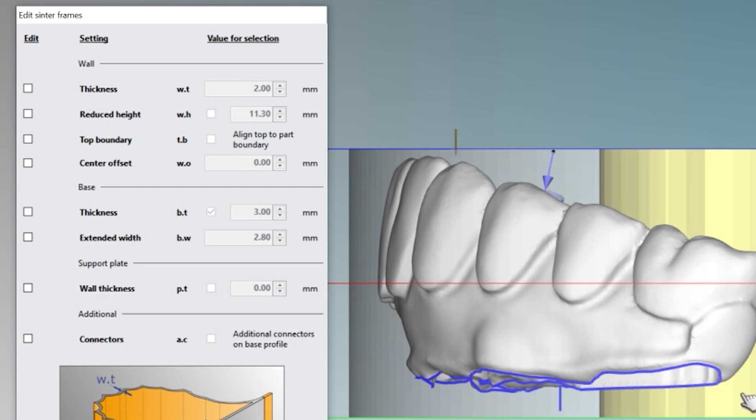Then it's going to open up all these edit programs that we can do to our sintering frame. What I want to do is I want to reduce the height of our inner sintering frame. Click on that box and then click on this box right here as well.